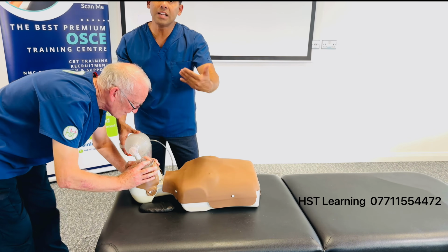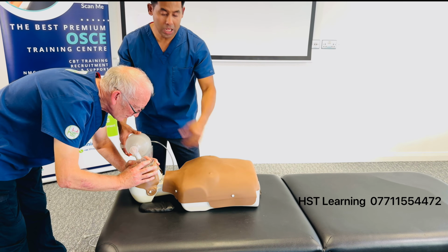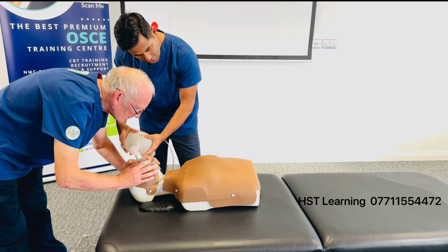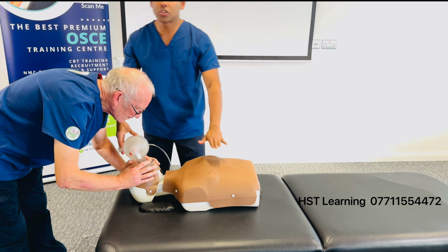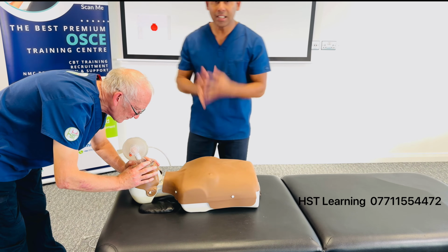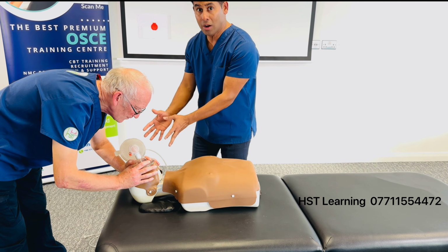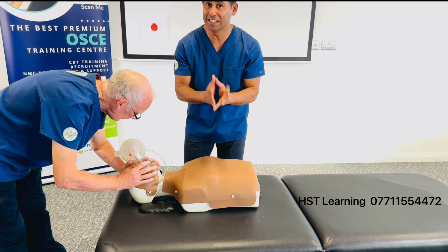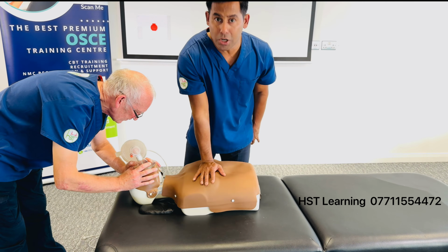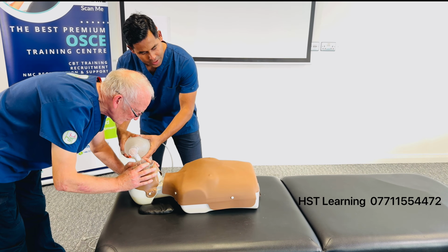When you're giving ventilation, just make sure you have the chest rise and fall. If not, you have not got a good seal there. Can you see it is having a chest rise? That means you're giving good ventilation. If it is unsuccessful, try again the first time. Don't waste too much time, because chest compression is critical to continue. So you've given 1 cycle of chest compression. You've given 2 ventilations. 1, 2.